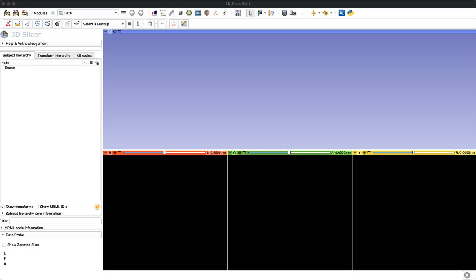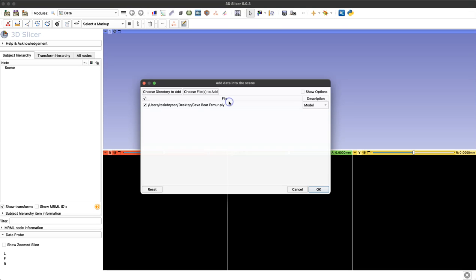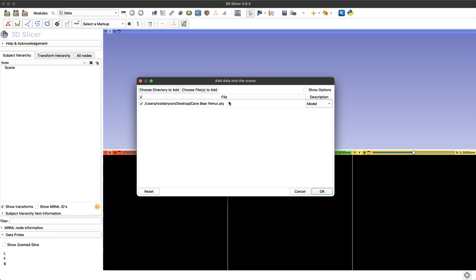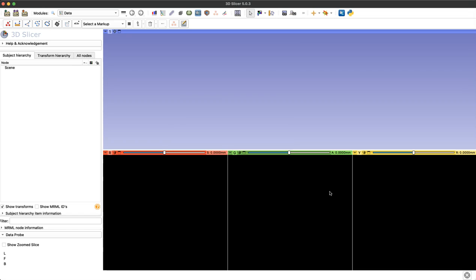First thing I'm going to do is drag and drop my 3D model that I've created into the 3D Slicer workspace. This window just confirms I'm loading a model, not a volume, so I'll click OK and my model will pop up.